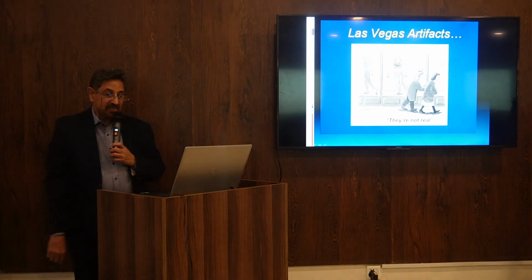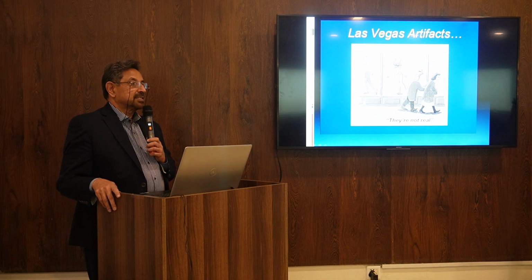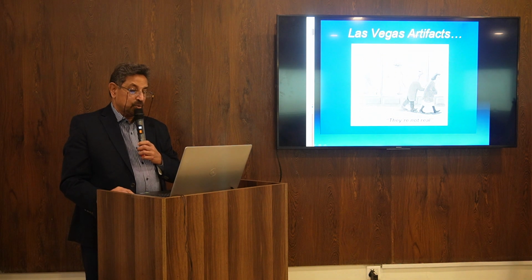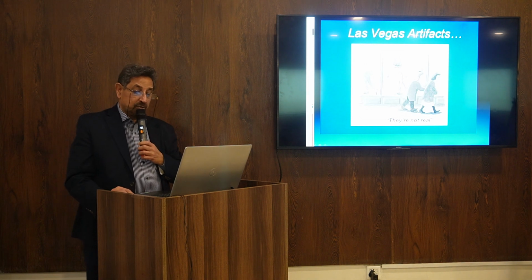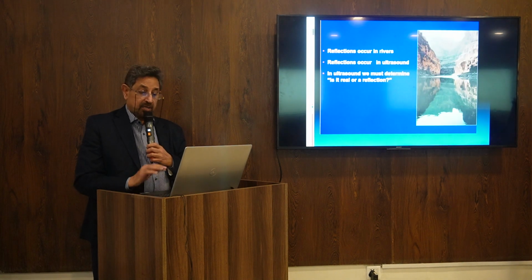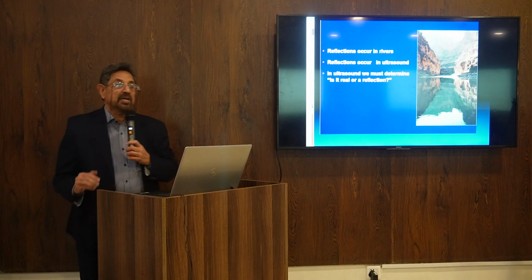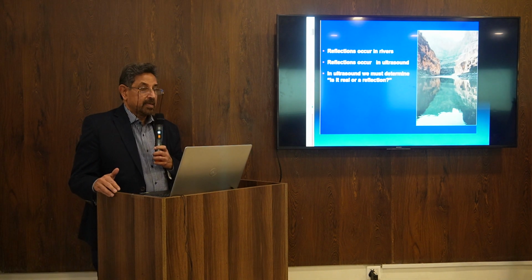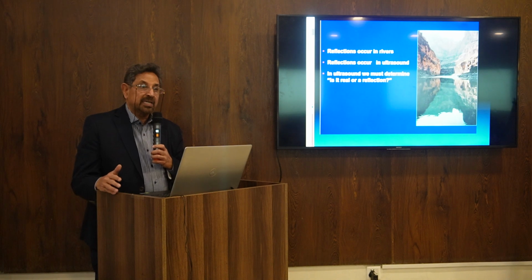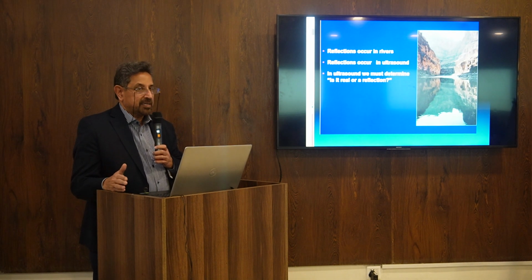Artifacts. Sometimes we are carried away by the artifacts. The real lady is holding the hand, the man is seen carried away by the artifacts, right? So, all these are not real. These artifacts are very useful sometimes. Rather, in ultrasound and Doppler, we diagnose with the help of the artifacts.